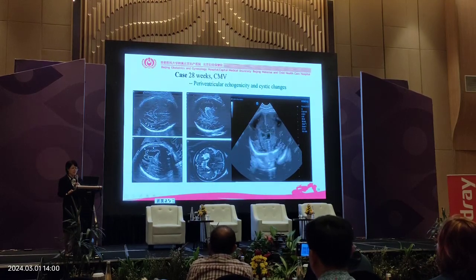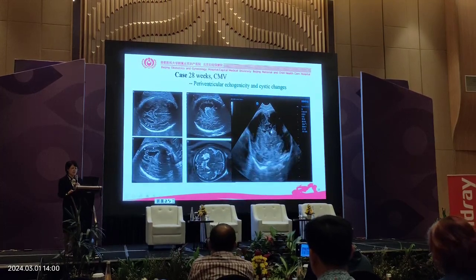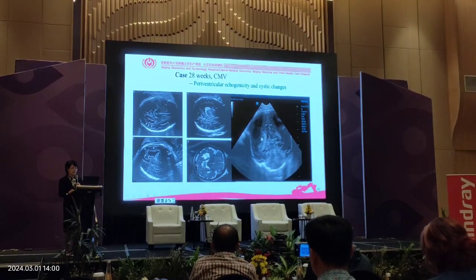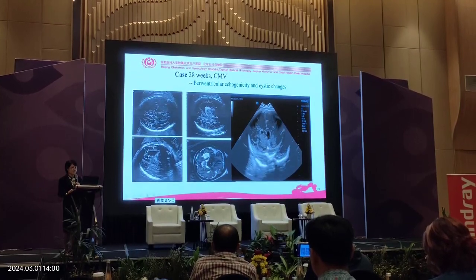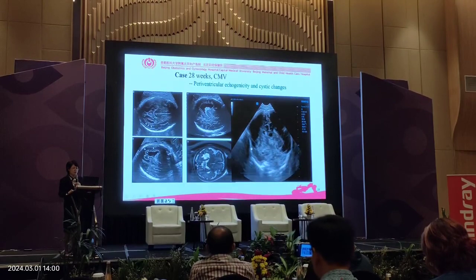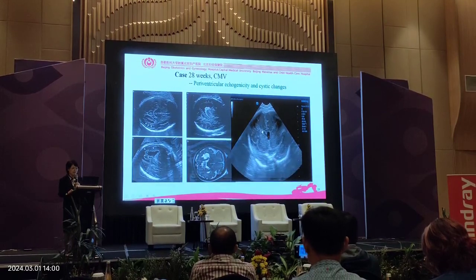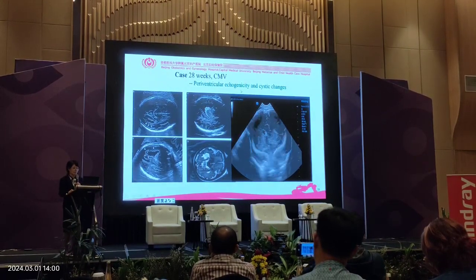Let's see the video. A cyst here, like magic here. Periventricular hyperechogenicity and the cyst here, you can see it's CMV.